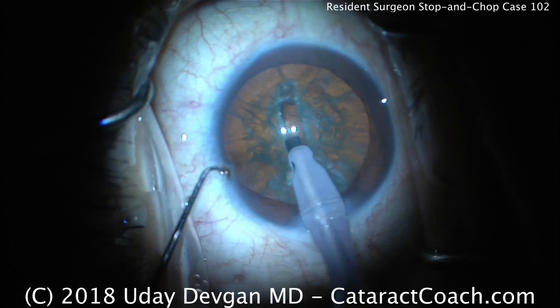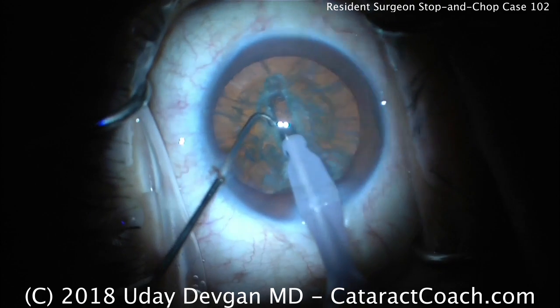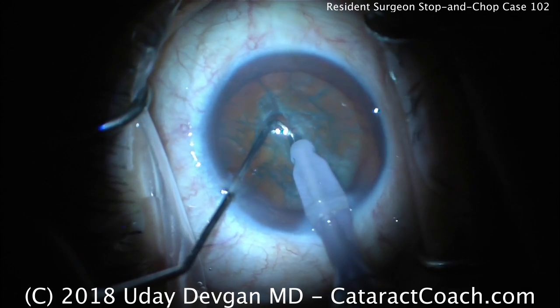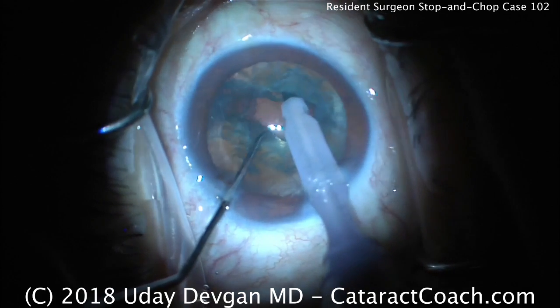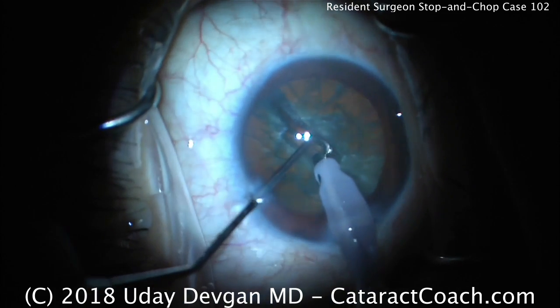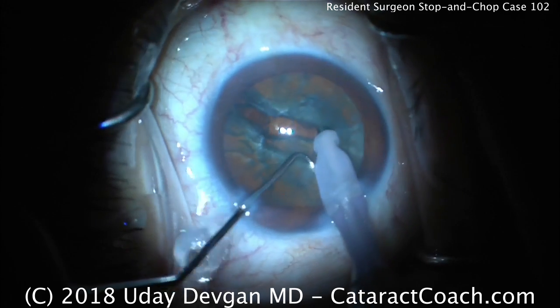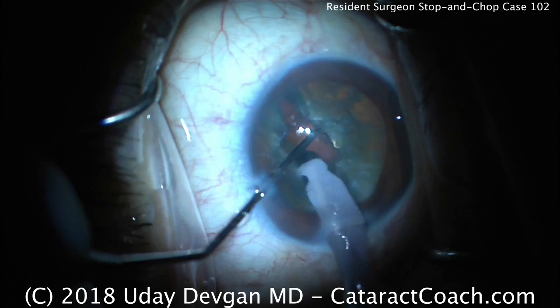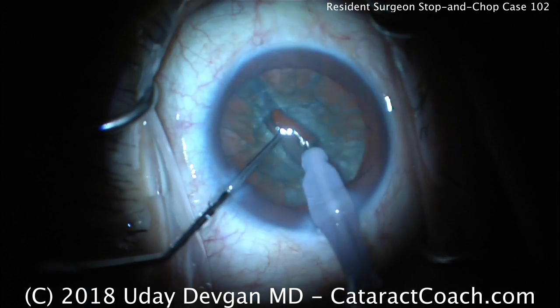Putting the chopper in the eye and placing both instruments deep within the groove. Let's see the split — that's excellent. Notice how the lens is cracked into two halves and care is taken to make sure there's full separation of both halves. Make sure it's really separated. That was the last hold-out sub-incisionally.